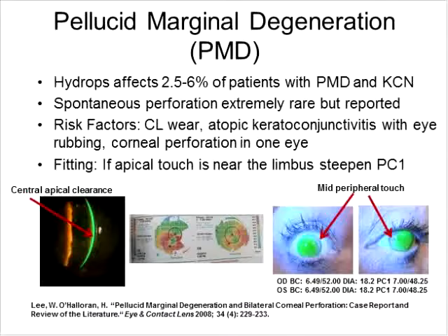So if you have mid-peripheral touch superiorly, you would still steepen the first peripheral curve. Okay, I think that's the answer the participant was looking for. I know sometimes you can make a rather small increase in the diameter of the lens to bridge over the limbal area as well.